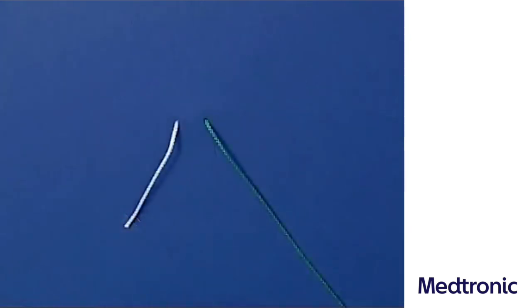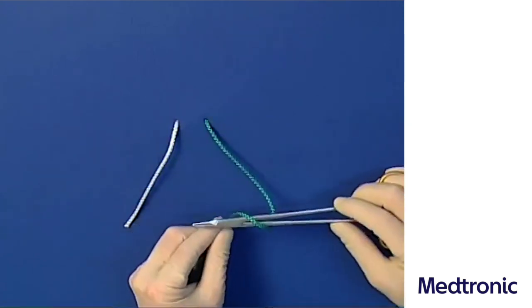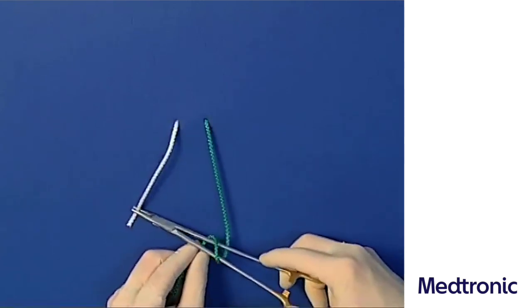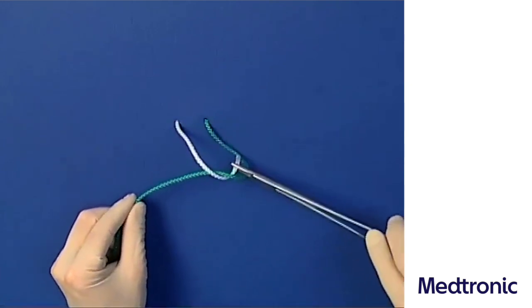Alternatively, the long suture end can also be wound around the needle holder from above. After grasping the short suture end, it is pulled through the produced loop. Both suture ends are again pulled crosswise.